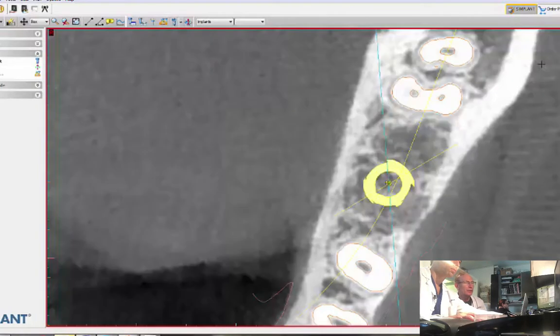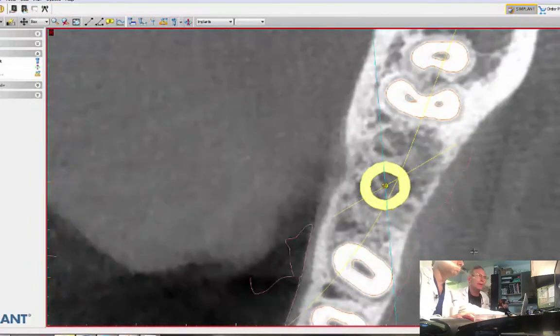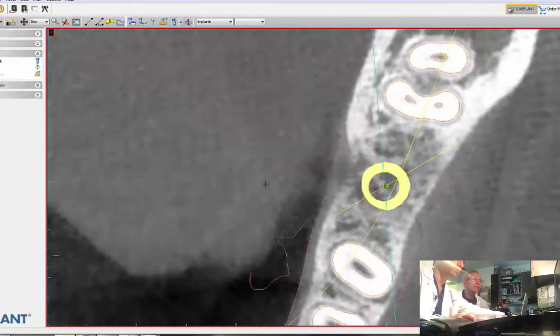Do you have a surgical note with a report that says you're going to graft the buccal when you go through the implant in because of the defect? I make the decision that, you know, now. Time of surgery? It's time of surgery or now. I can prepare the patient.